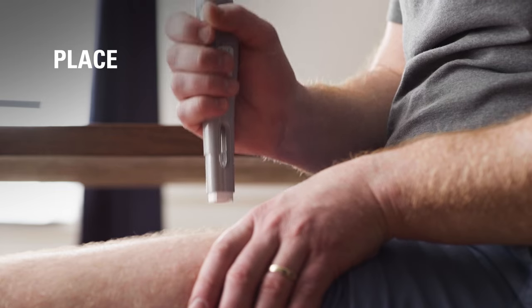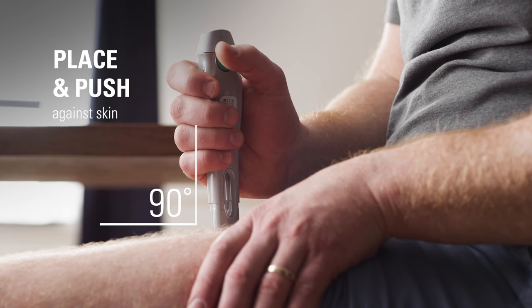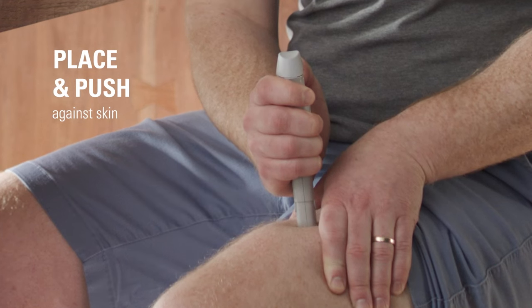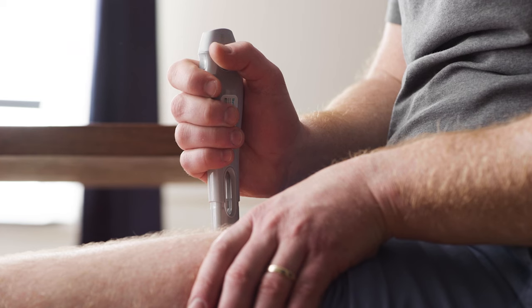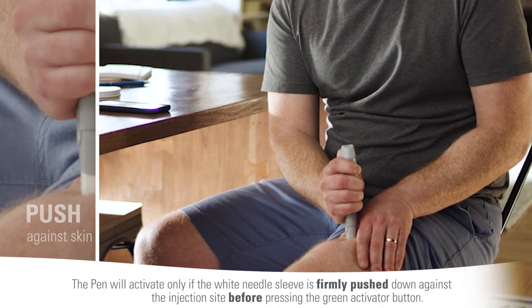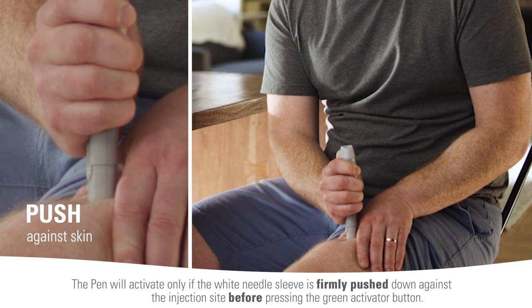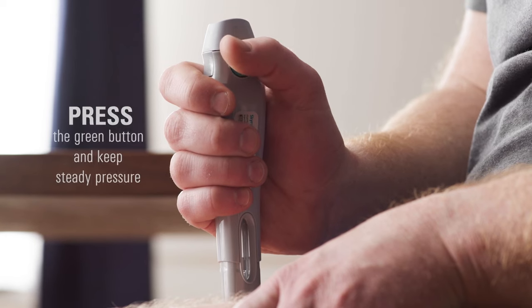Then I place the white needle sleeve straight against the raised area at a 90-degree angle and push the pen down against my skin. Throughout the process, I keep pinching the raised area and keep steady pressure against it. Now, I can see the green activator button and inspection window. The pen only activates if the white needle sleeve is pressed firmly down against me before pressing the green activator button. A loud click means the start of the injection.